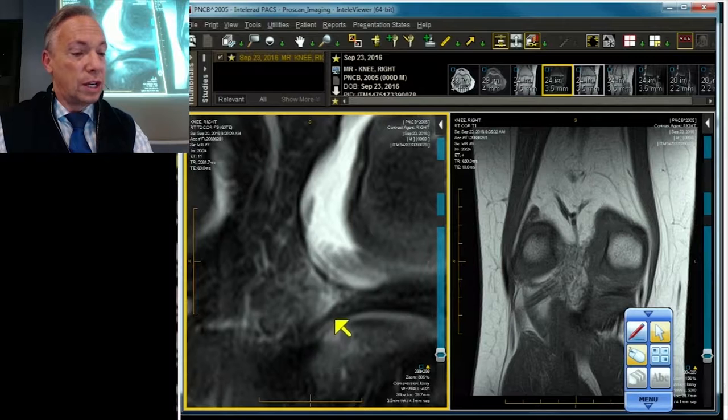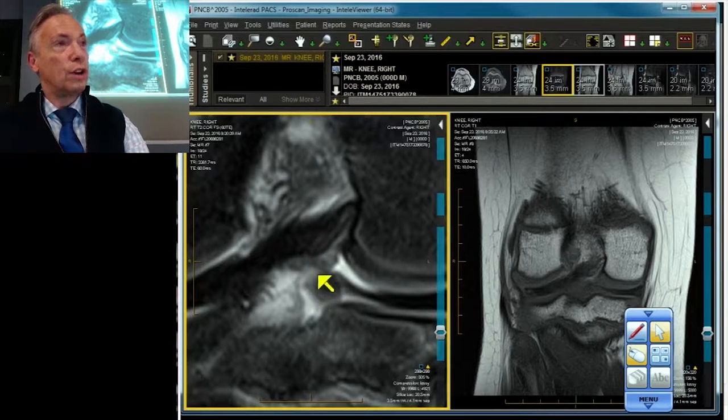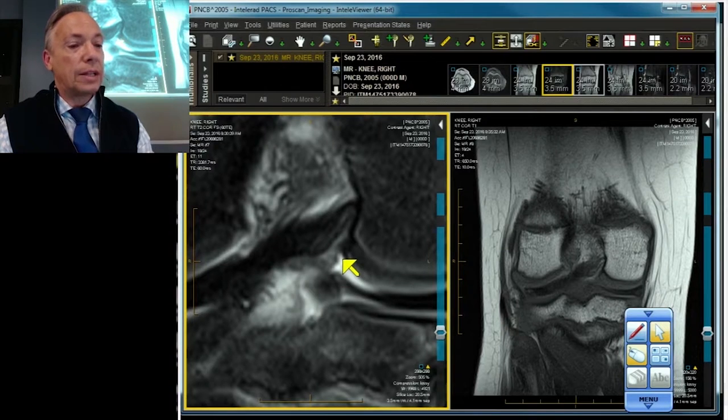Let's look at the next slice — still a little space. Let's look at the slice behind it. There are some of those frayed, fibrillated fibers of the root ligament that should flatten down on the tibia. And look at the meniscus — it's subtly floating upwards. It's a child with an isolated root ligament detachment from the medial meniscus.